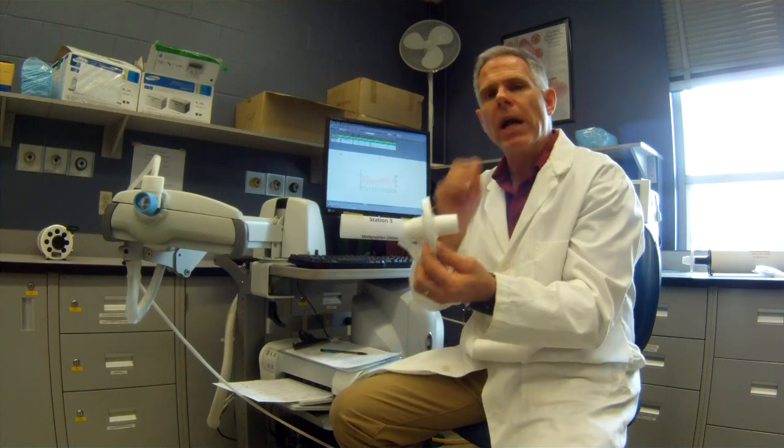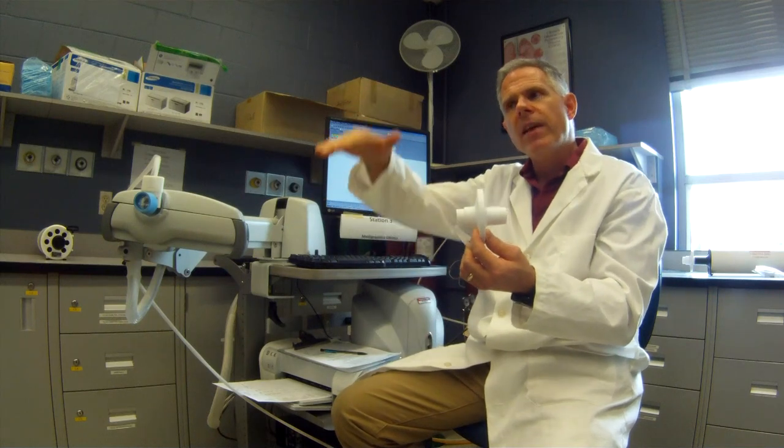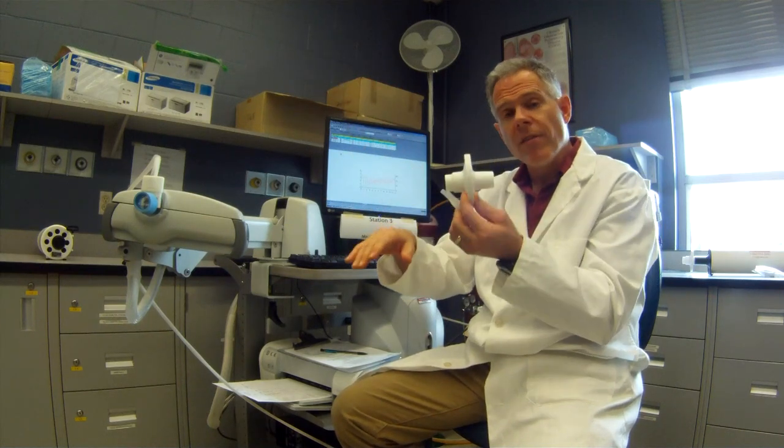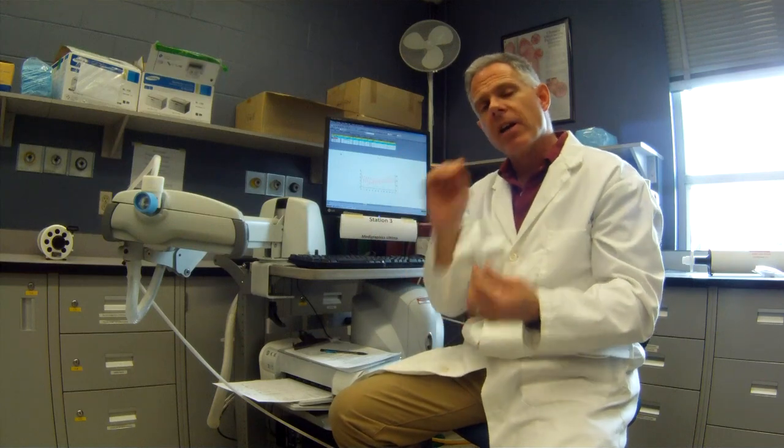Now this one, we gotta work them really hard, so coaching is really important. So we're gonna have them breathing along, just gently, through the device, and then when I tell them, they're gonna pick up the rate. So breathe hard and fast, keep going, in and out. And we're gonna coach them for that.